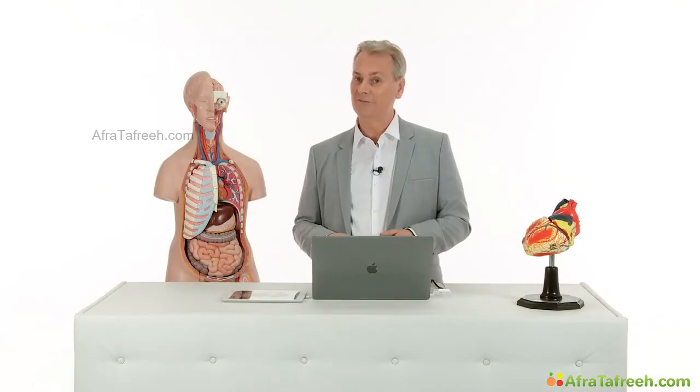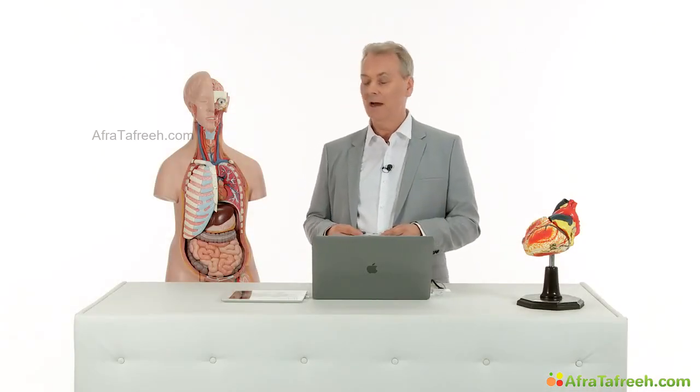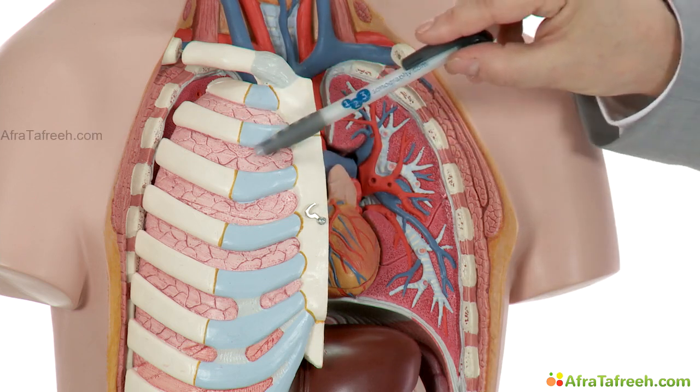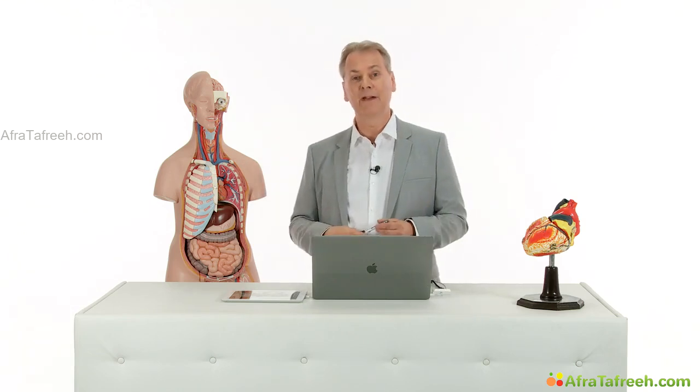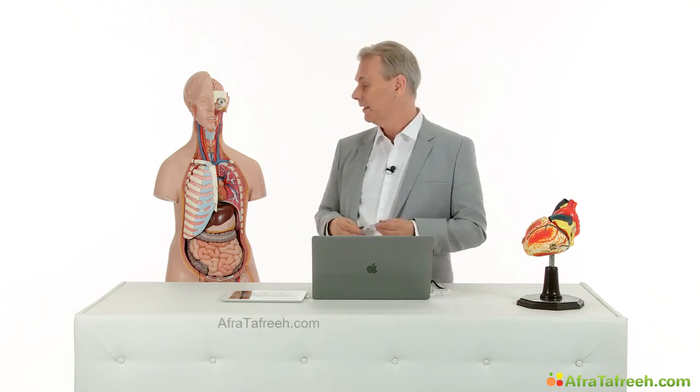When you image the heart, it's very important to understand where it actually lies within the chest. Parts of the heart are hidden behind the sternum, the ribs, and the lung. All of these structures are barriers to ultrasound, so we'll be using specific windows.